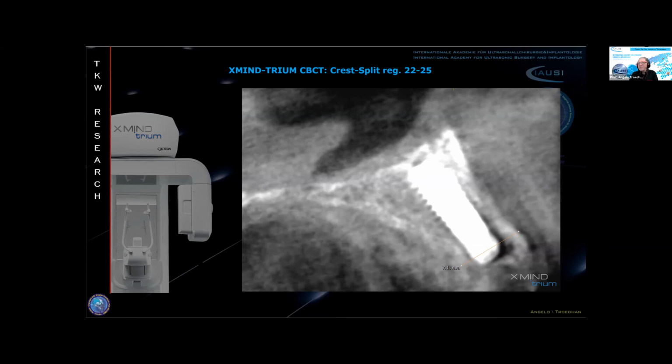It's the protection against resorption, or if resorption happens, it doesn't expose the neck of the implant. And you have almost 2 millimeters on the palatal side of bone coverage of the implant. This is a perfect result, which you can hardly achieve with lateral autologous bone block appositioning in the most least traumatic way for the patient, because once you do only a very simple cut on top of the alveolar crest, of course, there will be almost no swelling and there will be almost no pain.